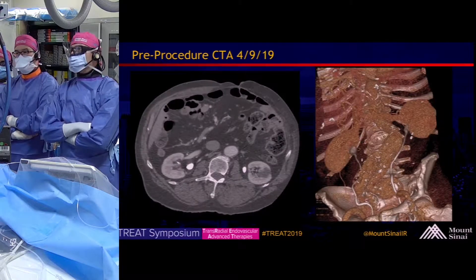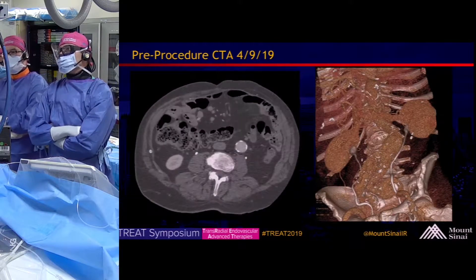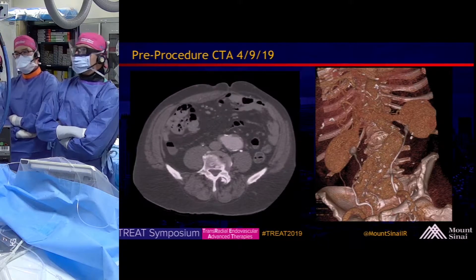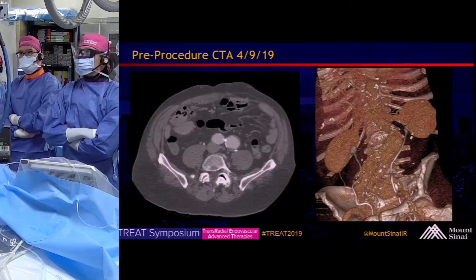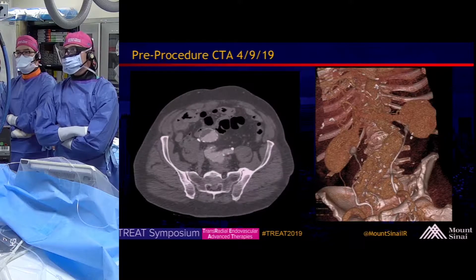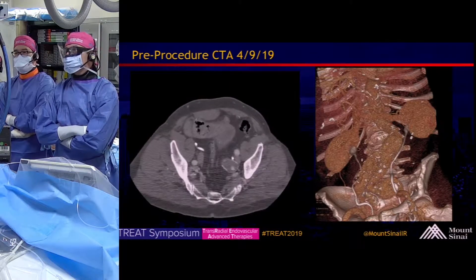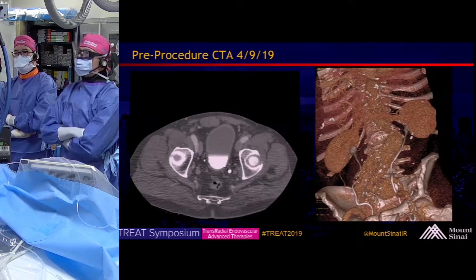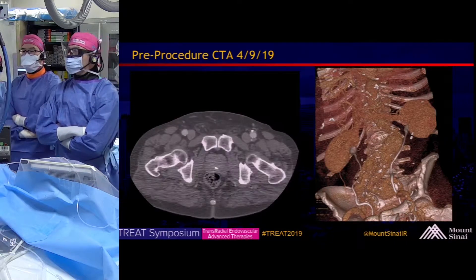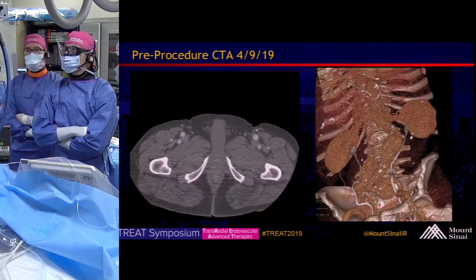On the left of the screen here, you can see an infrarenal abdominal aortic aneurysm, ectatic common iliacs bilaterally, lots of tortuosity, and a very large 4.2-centimeter left internal iliac artery aneurysm. There's a 3D reconstruction on the right as well.